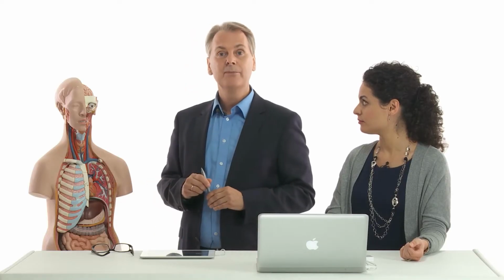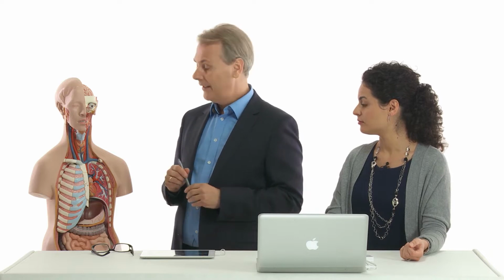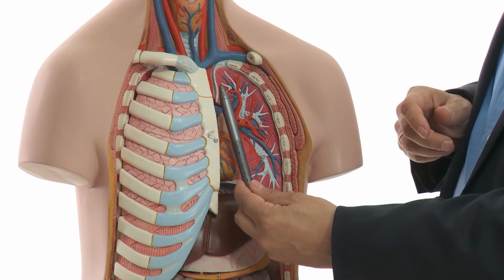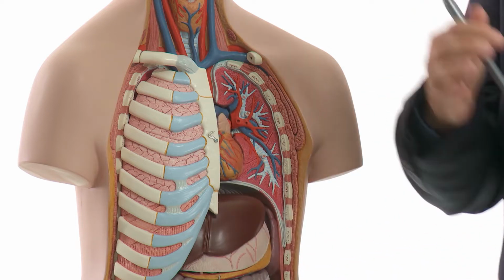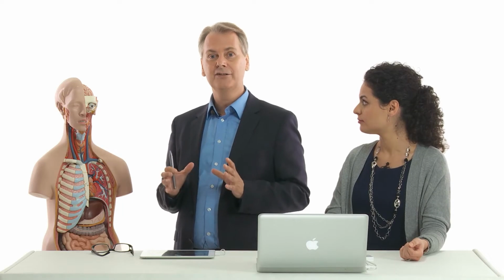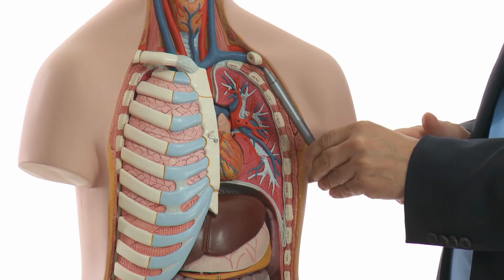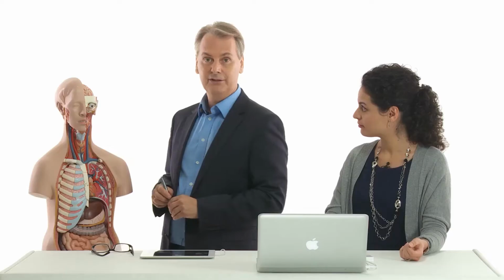Vice versa, if you have a patient who is very slim, then the heart will have an axis which is more like this, which has the problem that it is now kind of hidden behind the sternum here. That makes it difficult as well. So the ideal patient is the one that has an axis somewhere in the middle here and not too far lateral and not too far medial, because remember, we have the lungs in the lateral region.